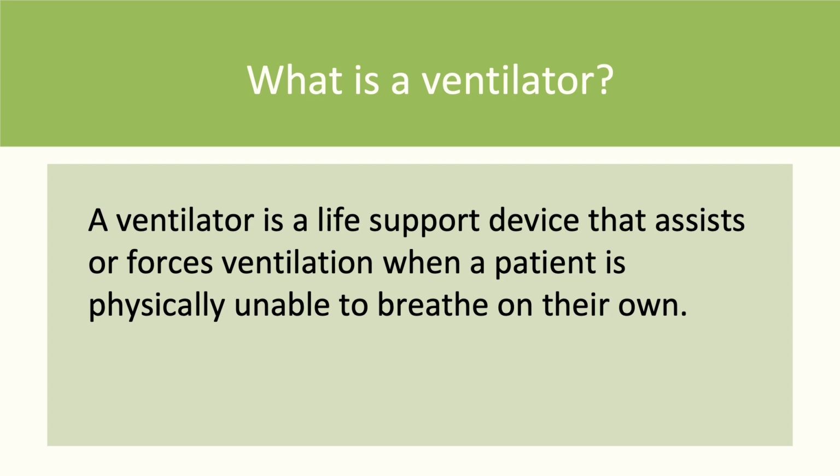A ventilator is a life support device that assists or forces ventilation when the patient is unable to breathe on their own due to some health conditions.